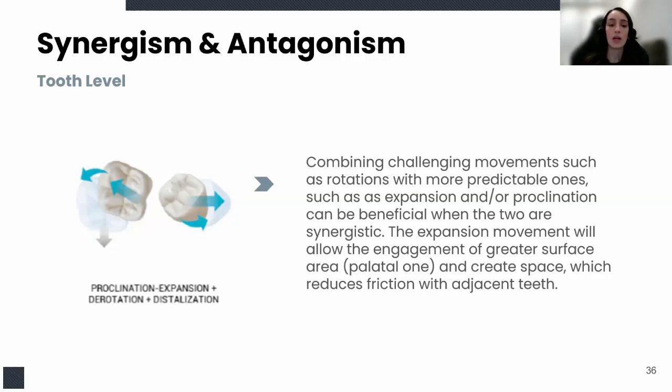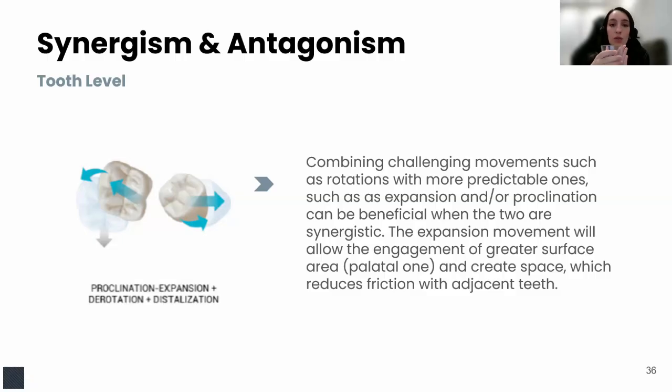And this is simply because, if I take this glass cup as an example, we already know the problem with cone-shaped teeth in general. With aligners, movement is more predictable if we have more surface area that is wrapped by the aligner. Cone-shaped teeth are a little bit difficult to grab, especially since they are not just standing on their own. They usually also have teeth adjacent to them, so they're generally very difficult to grip by the aligner. So if I want to rotate this tooth, it's definitely going to be challenging.